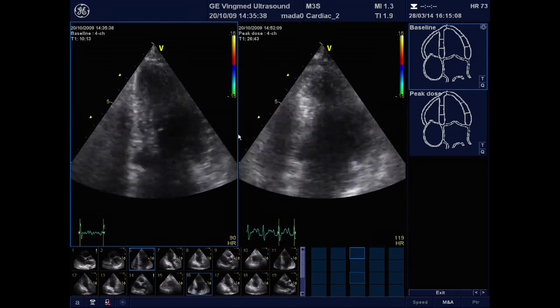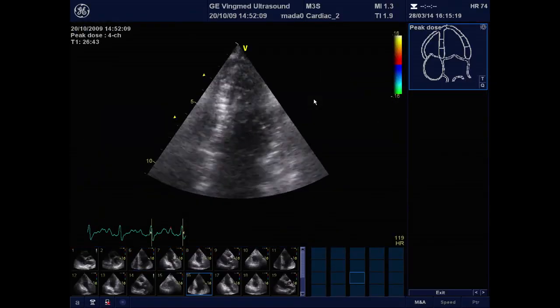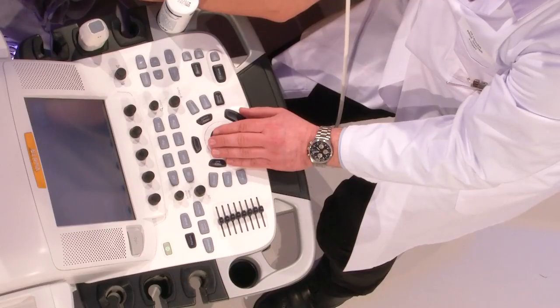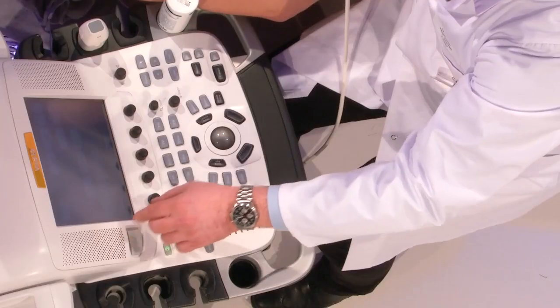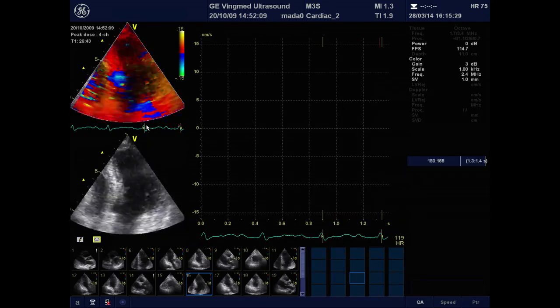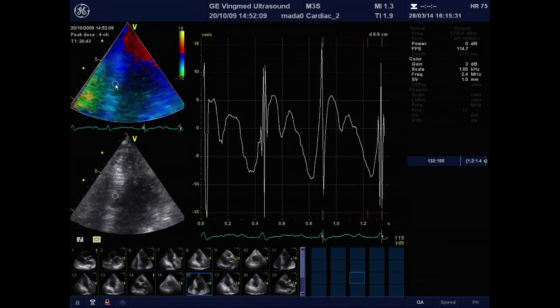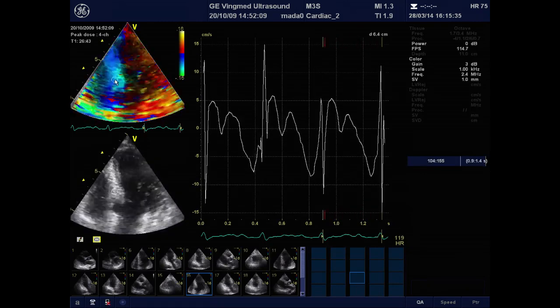You see this is everyday live quality, so this is not a perfect case. And you might wonder if there is anything going on in this heart or not. Is there ischemia during the stress or not? How can we find out? We go to our peak acquisition and we switch to the analysis tool, and we can immediately analyze the tissue Doppler data.